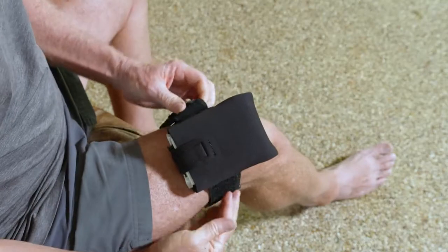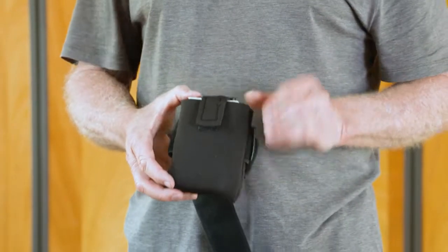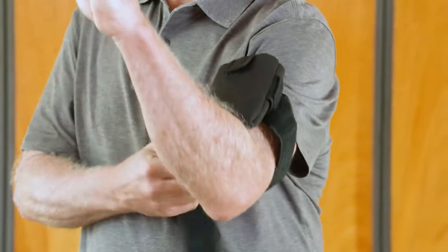You can trim excess strap. If you would like to wear the case on your arm, slide your hand through the loop.